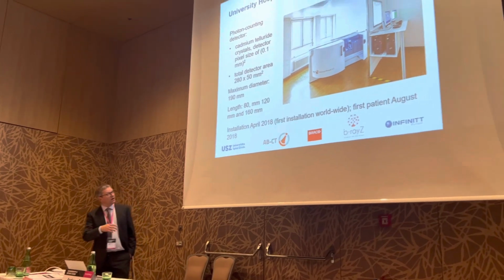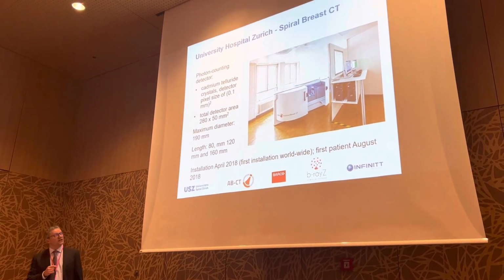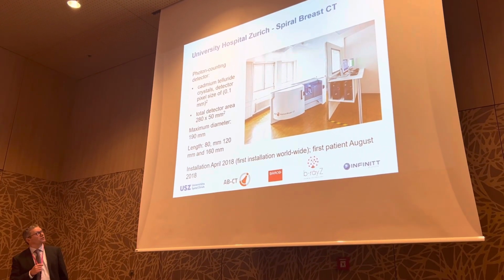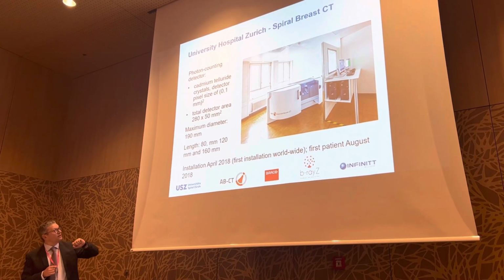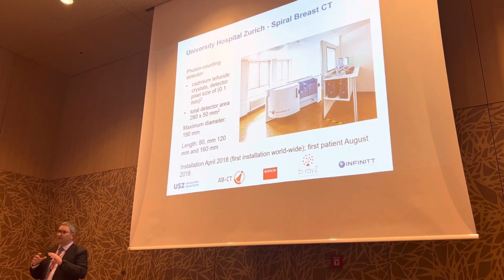So about 5 years ago, we got the worldwide first installation of a breast CT scanner at the University Hospital in Zurich. This is how it looks in reality. What you can already see is that there are different lengths which you have to adjust.